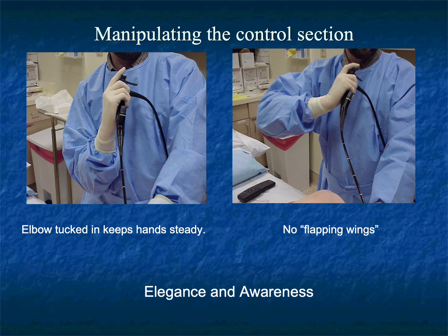That's why these slides emphasize no dancing around the patient and the idea of elegance and awareness, which contain an important educational philosophy. Bronchoscopy performed well appears calm. Efficiency develops from restraint rather than force.